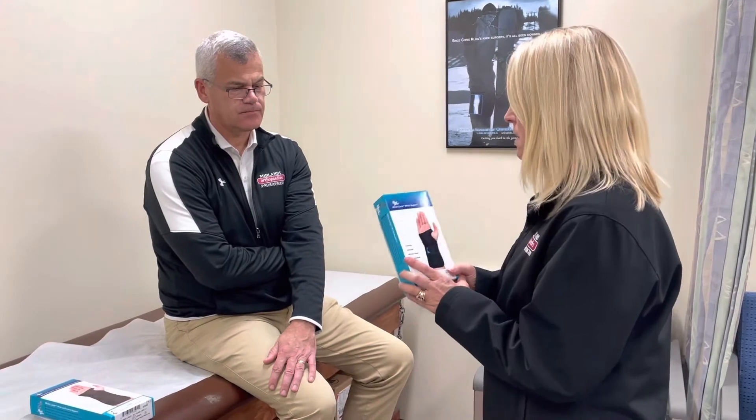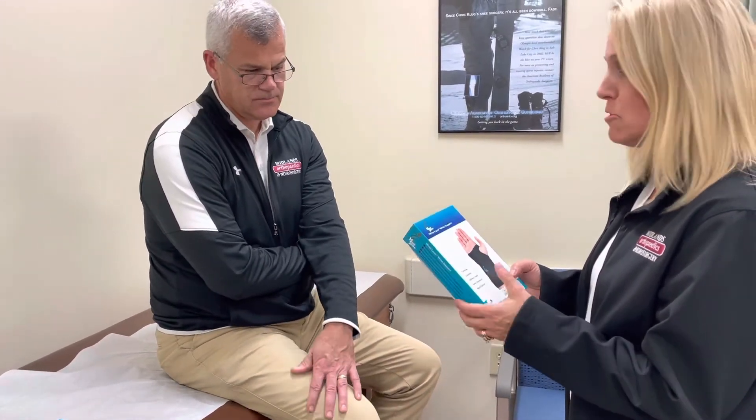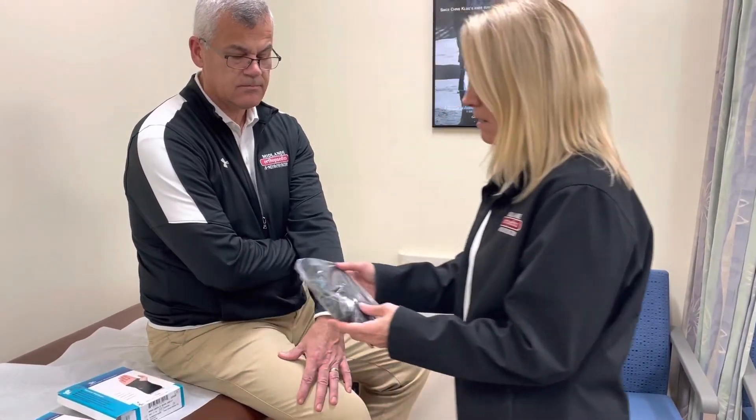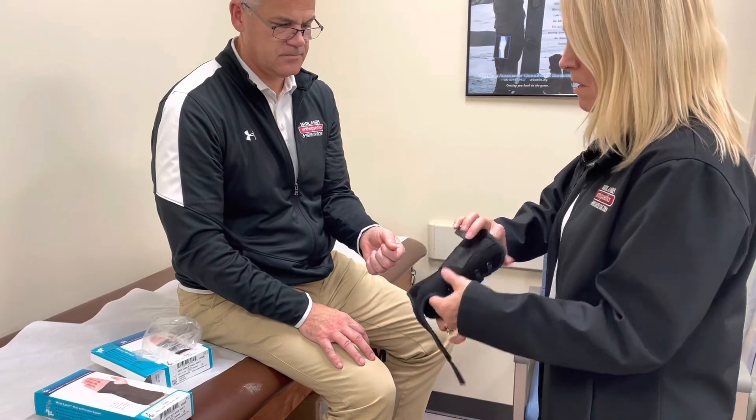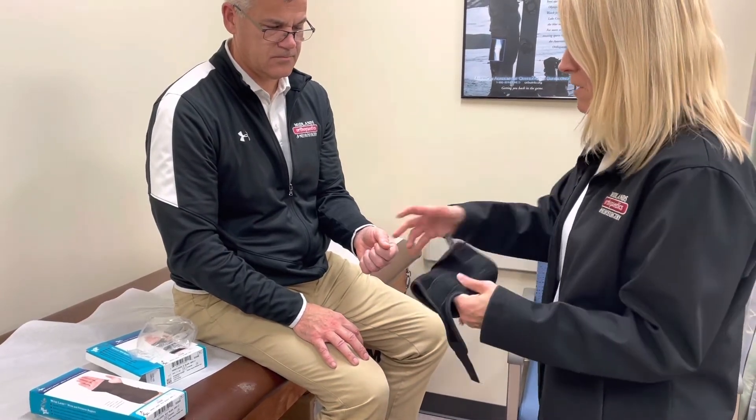These are universal sizing, meaning we have lefts and rights. This universal brace will fit a size small through a size large, so the majority of our patients will fit in this. We do have pediatric sizes, extra small and double extra small, as well as an extra large. Our wrist braces are right and left side specific.